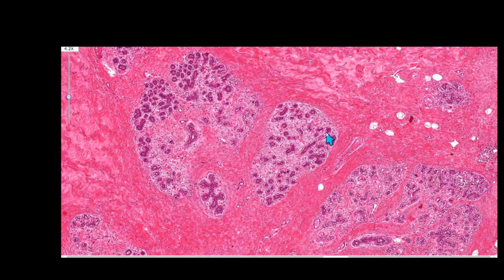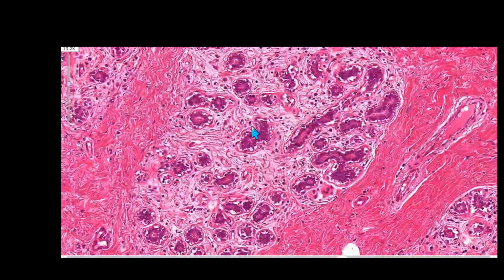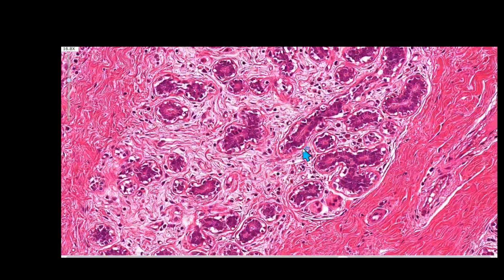There is connective tissue mesenchyme inside and in between the terminal ductal lobular units. This is one TDLU, this is another one, this is a third one. If you squint, you see the huge difference in color between the intralobular and the interlobular connective tissue. The interlobular connective tissue supports the basic elements. The intralobular is a functional connective tissue. The luminal cells that used to produce the milk are getting the nutrients through osmosis.